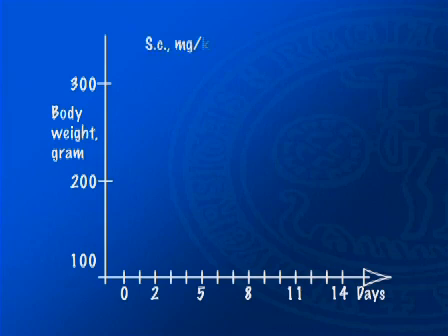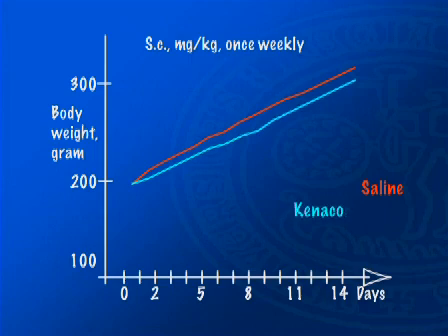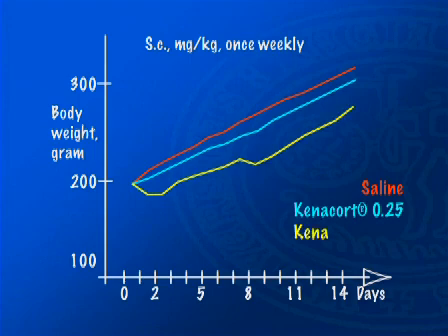As adult rats grow physiologically and can increase in weight by some 40% during an experiment lasting 2 or 3 weeks, it is possible by weighing the animals to obtain an understanding of the degree to which the treatment has slowed the increase in body weight, which can be taken as an expression of toxic effects.